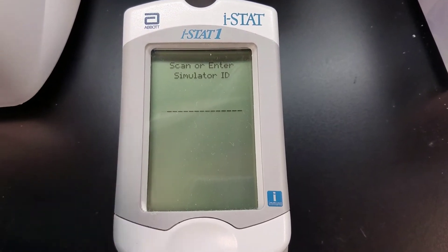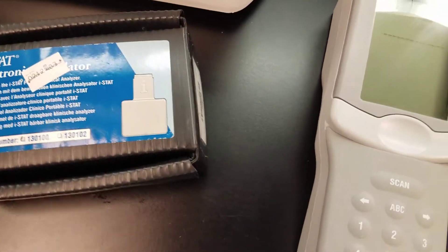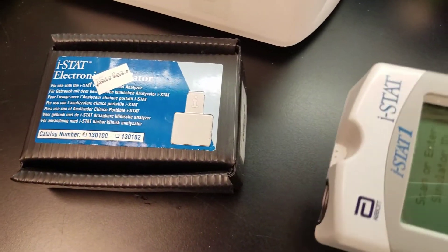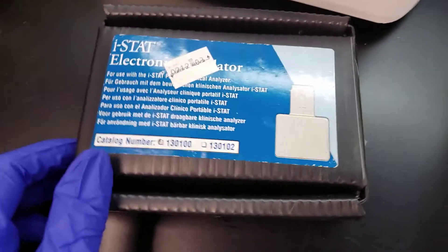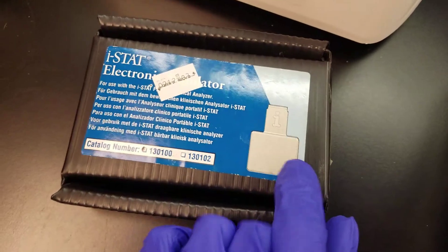We have the simulator ID as a barcode on the side of our box, so I'm going to scan that now. It's now going to say 'insert your simulator.'